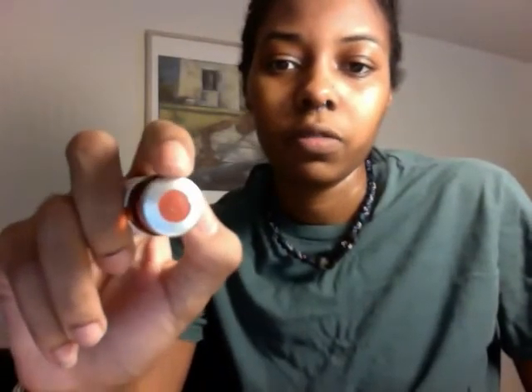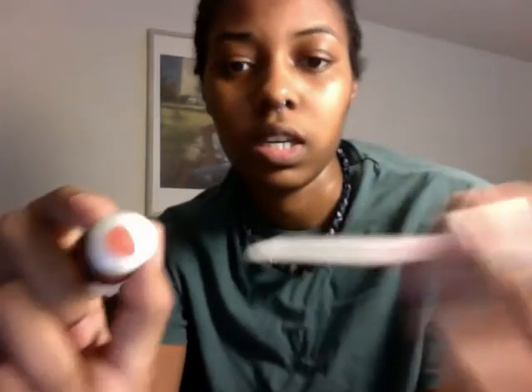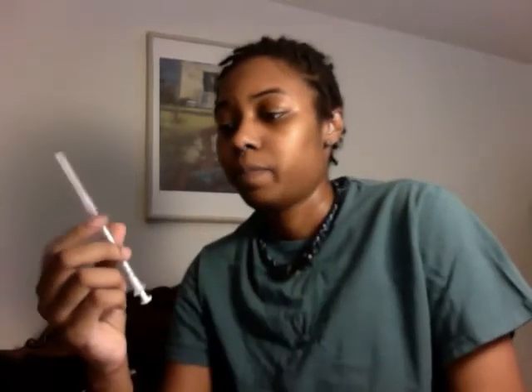I've already taken the little metal tab off, but when you first get your T there's a metal tab you have to pop off with your fingernail. Every time you do an injection, you have to clean the rubber membrane on the testosterone vial because it's not sterile, and when you push the needle through you could carry germs into your T. So wipe it off, clean it real good, and let it air dry — don't blow on it, because you have germs in your mouth.